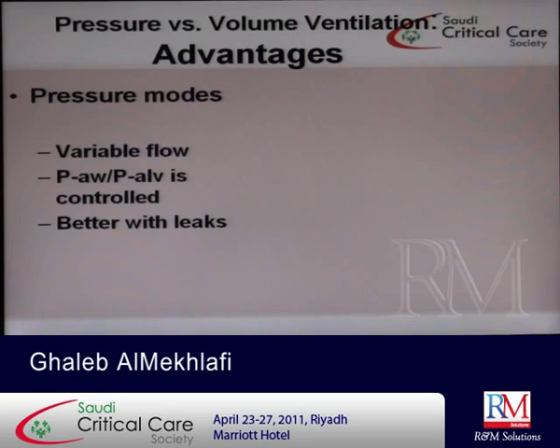But if it is the opposite way, if it is in the volume, once that amount of volume is reached, whether there is a leak or not, it will stop. So this is one of the advantages. If there is a leak, you need a better, or you can control it more with pressure.